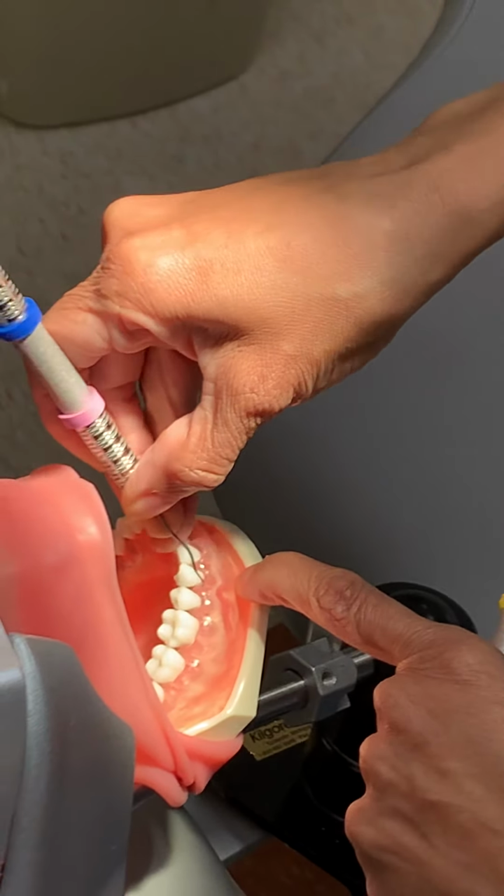And all the way in a proximal. Okay, so that's how you do the posterior. The same applies for the maxillary. You choose your correct working end, same way.